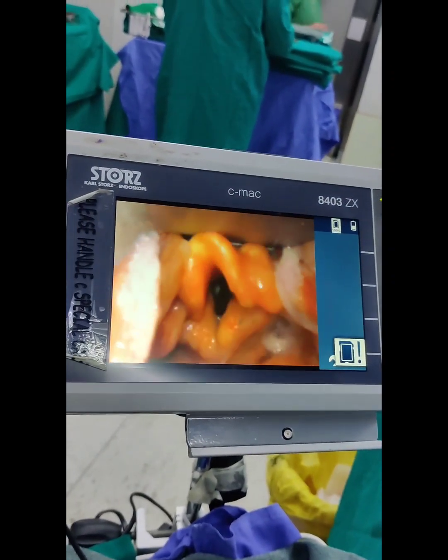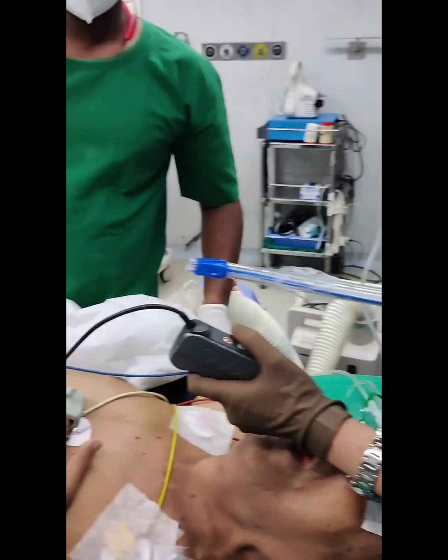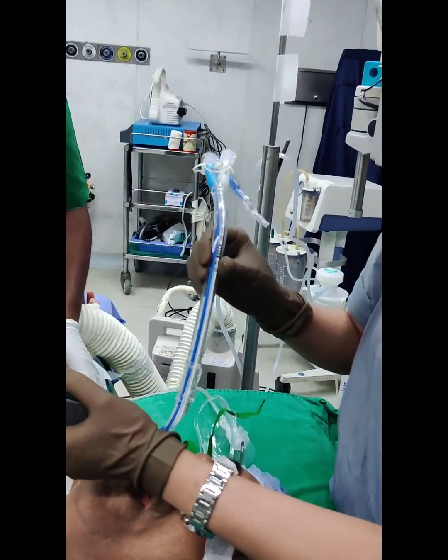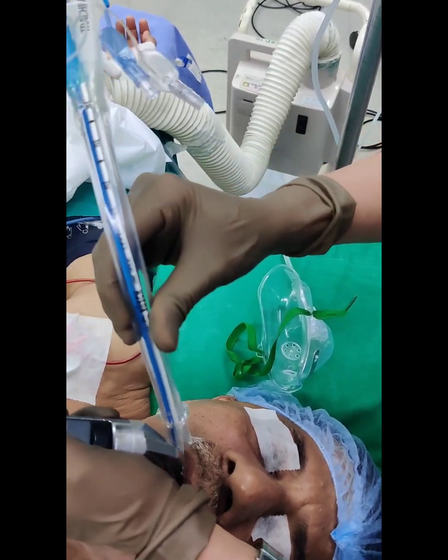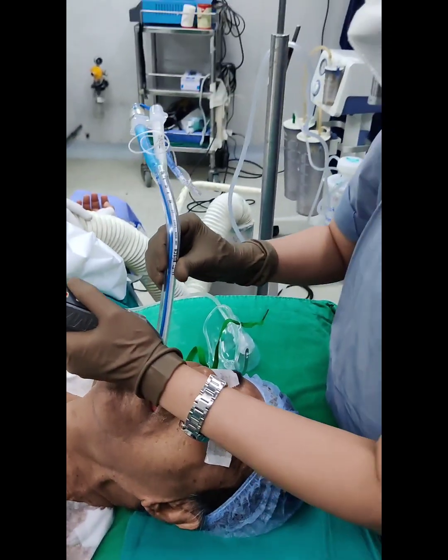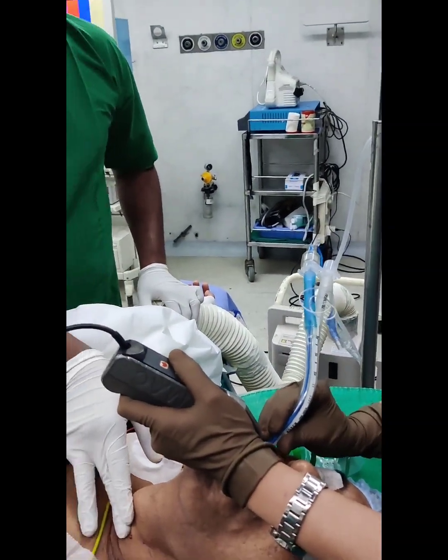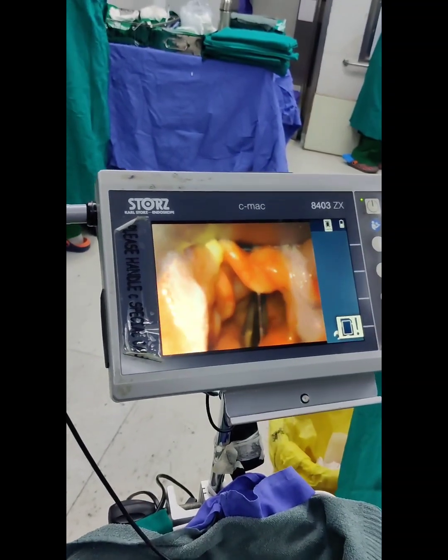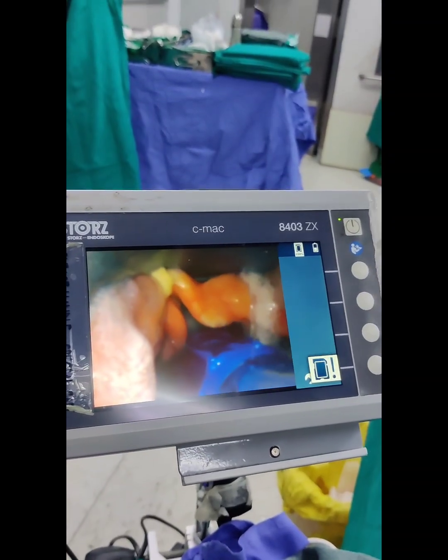An appropriate size DLT is one in which the main body passes without resistance through the vocal cords, advances easily, and the bronchial part approximates the length of the respective main stem bronchus. By direct laryngoscopy or video laryngoscope, the vocal cords are visualised and the appropriate size DLT is gently advanced with the tip of the bronchial concave curve facing anteriorly through the vocal cords until the bronchial cuff passes through.